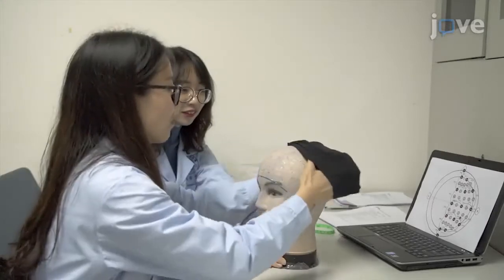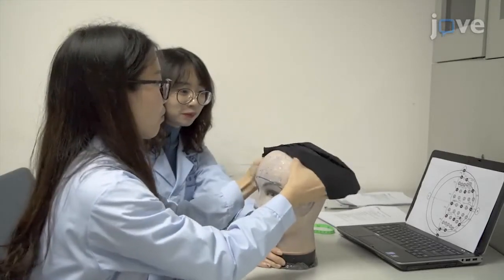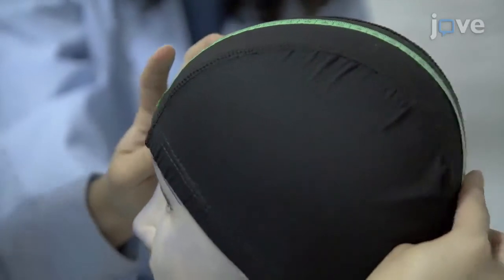To prepare an electrode holding cap, place a swimming cap on a head form and measure the distance between the nasion and inion.